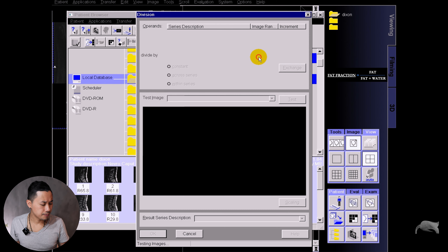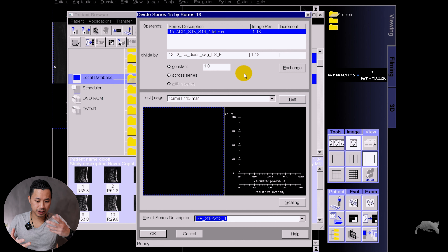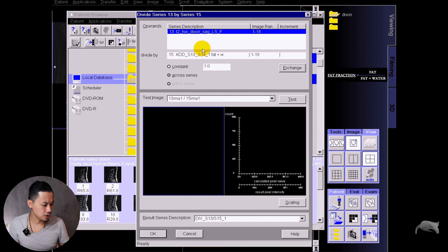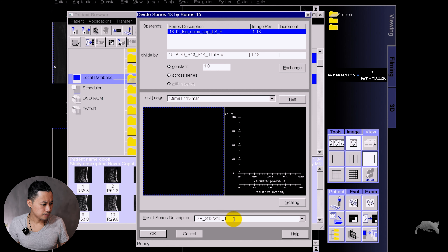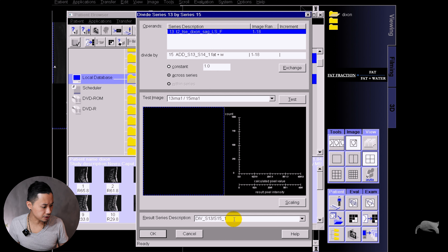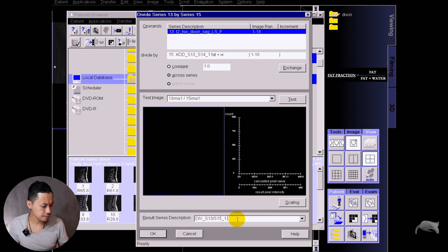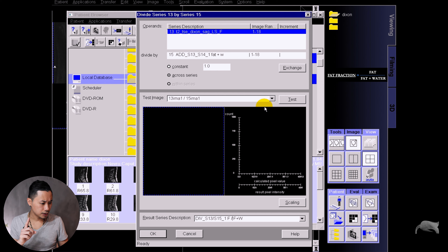I'll name it 'fat plus water' and put OK — you can write whatever you want, it's only important that you know what you wrote. Now we're going to mark the fat images and try to divide that by fat plus water. We mark these two, go to Evaluation, and go to Divide. It says fat plus water divided by fat — that's wrong, we need to exchange this.